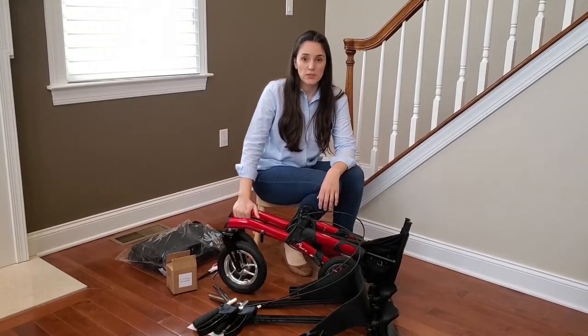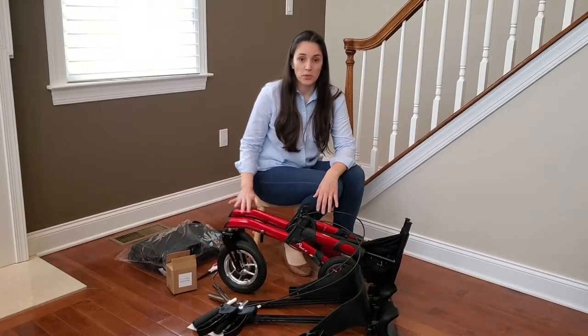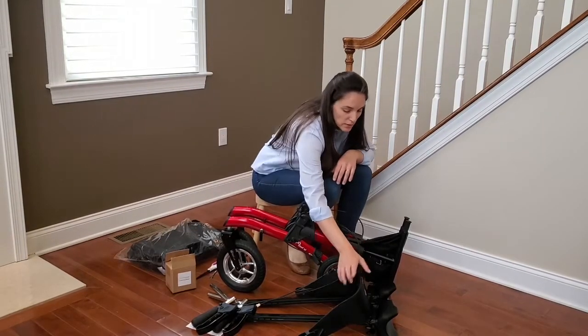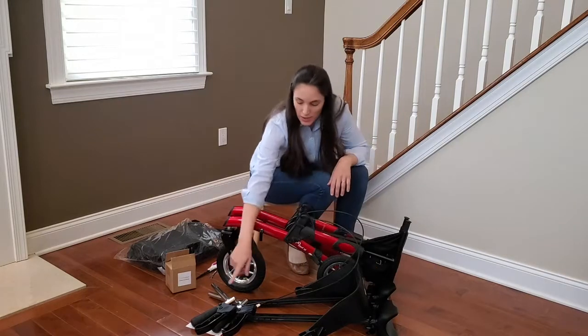Once you remove the protective materials, these are the components you're going to see: the structure of the walker, the backrest, the arm support, and the handles.